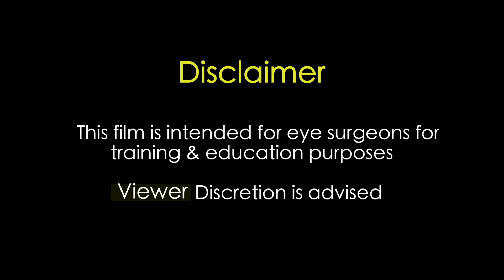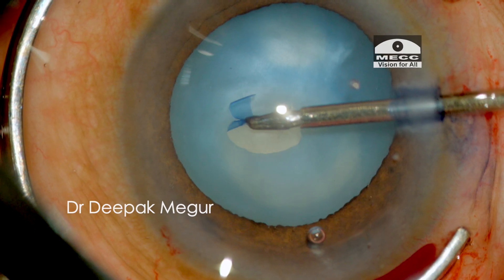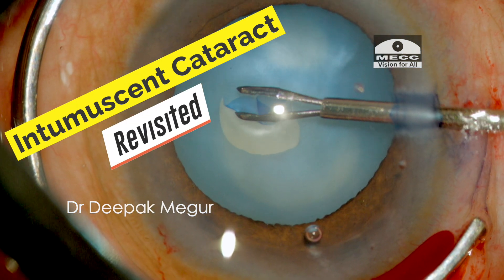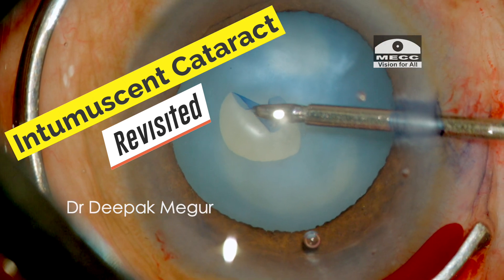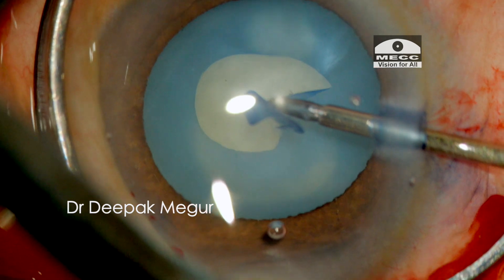This film is intended for eye surgeons for training and education purposes. Viewer discretion is strongly recommended. Hello friends. Today I am revisiting the subject of intumescent cataracts, which continue to pose challenges, and I would like to share a few of my thoughts regarding this.